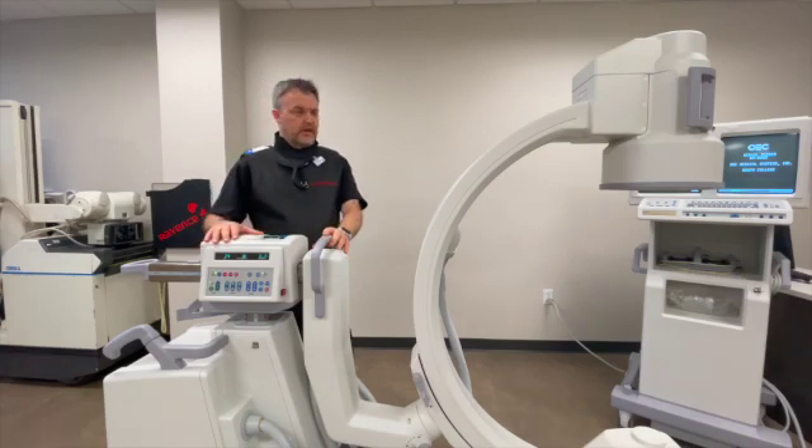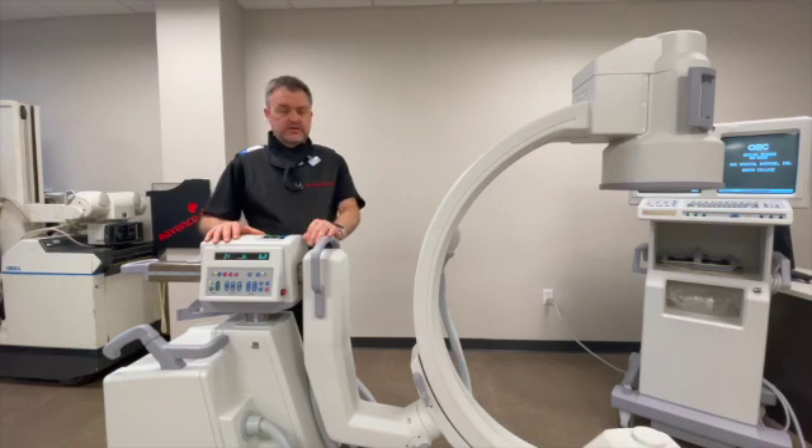Some procedures that would involve that tilt function include pelvic imaging, tibial plateau surgeries, calcaneus, and things of that nature.